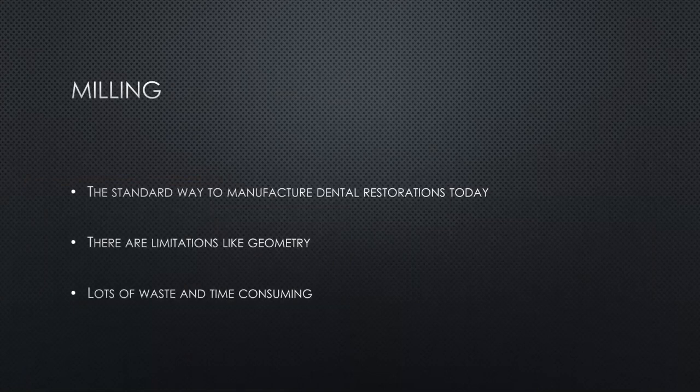We're not going to go into too much detail. It's a segment of our industry that's matured quite a bit. When I first started my career about 15 years ago, every single trade show you went to and every single booth had a milling machine, and every company was selling their own brand of zirconia, it seemed like. And it's still the most reliable way to produce digital restorations, but there are limitations.